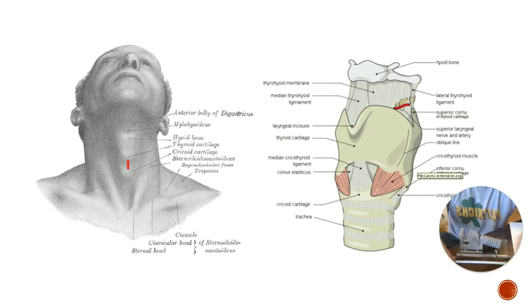Vertical, then horizontal. You're going to take your bougie. This looks like a straw, but it's actually a bougie. And you have your finger in here. Okay, sick, I'm in the space. They're not going to die. I'm going to save them. Put your bougie in there like this. Okay, and now you have your bougie in there.